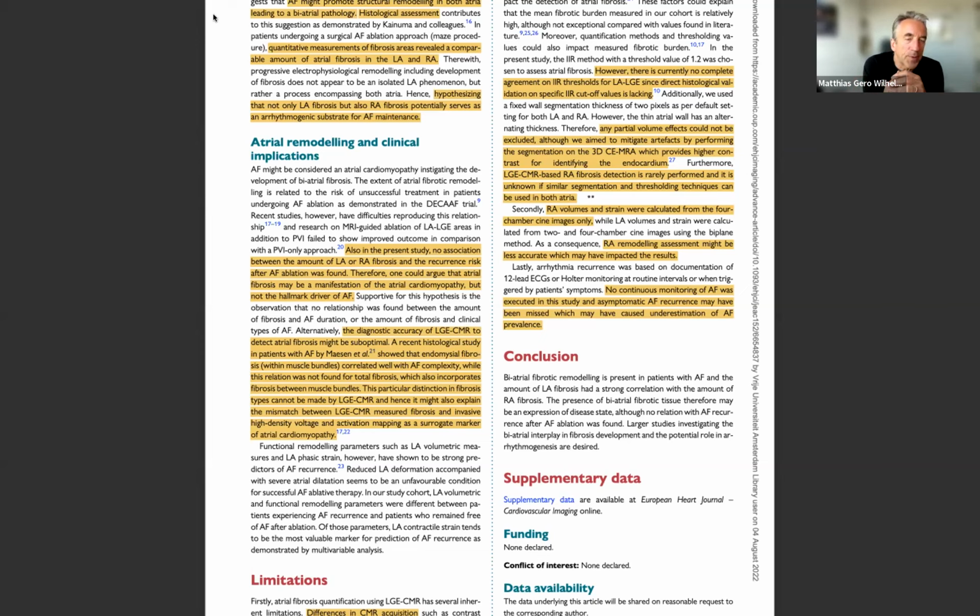So with respect to identifying the wall, making sure that you do not include other tissue, and especially for the late enhancement, which has been a huge discussion, is the number of pixels we actually have enough to comment on tissue characteristics? I can comment maybe first, and then Luke can add anything.